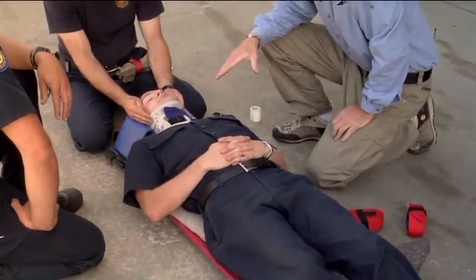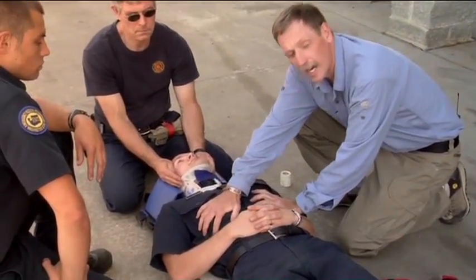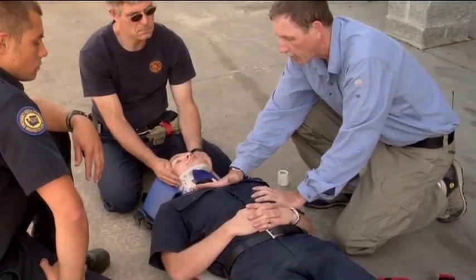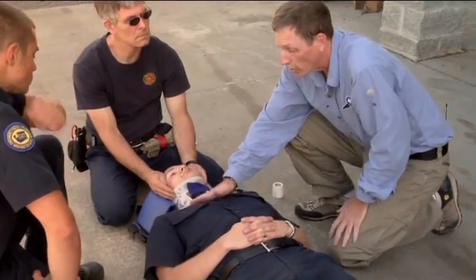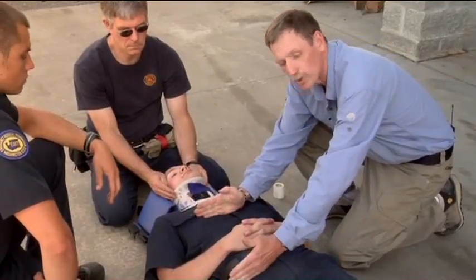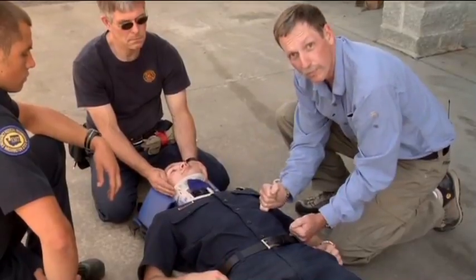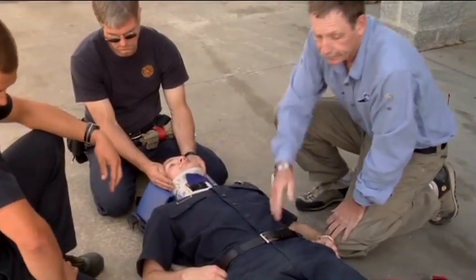Now, when we look at the upper chest, down here we have floating ribs, and so if we squeeze tightly here, we're going to restrict the breathing of the patient. But we can push up here on the non-floating ribs all day long and they still have good chest rise. So an area like that, we can cut across it laterally and really weld it down. From about here to here is sort of a wimpy band. It's a spot that we don't want to put lateral straps across. So we're going to make sure the straps go at a diagonal there.